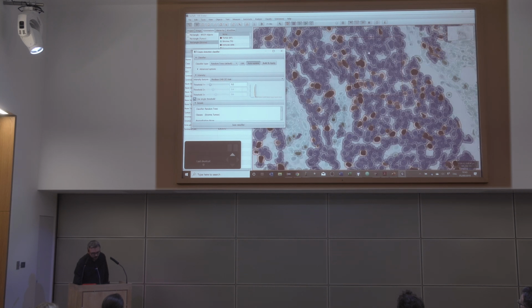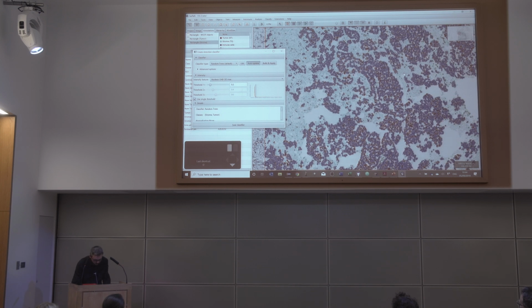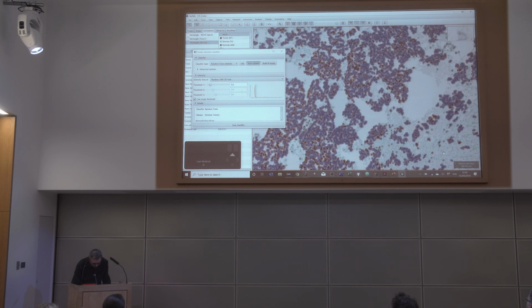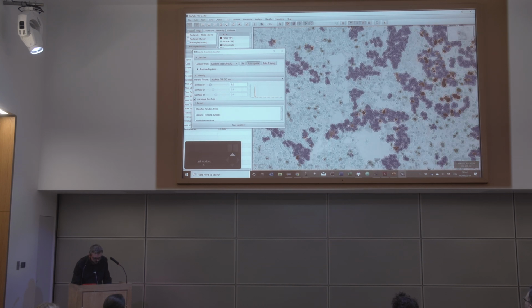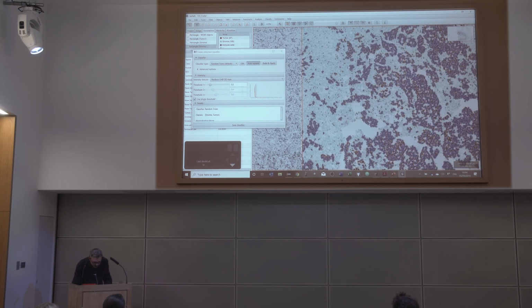So now we have blue as negative in tumor, red as positive in tumor, and then light green or dark green as positive and negative in non-tumor. But because this classifier is trained very quickly, we are able to go into other regions, give it more examples, and then interactively train it however we need to if we see that it's making mistakes.